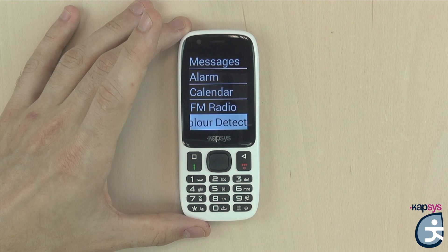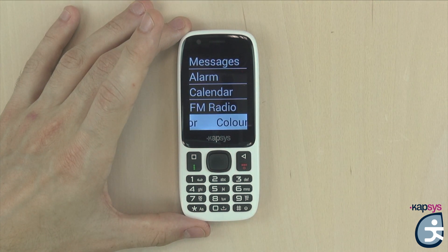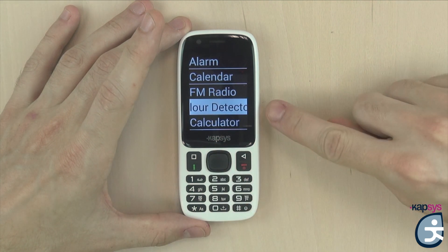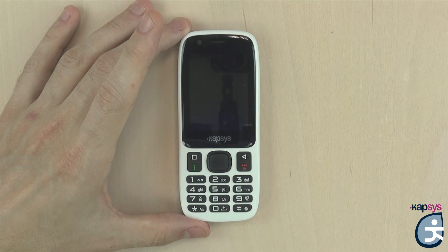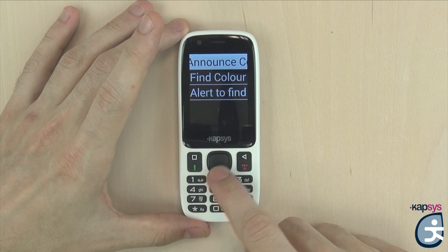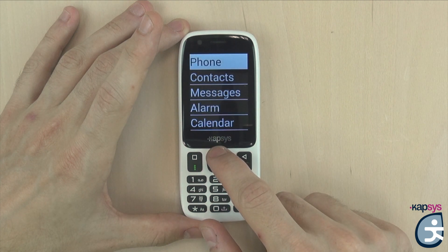By default, the text displayed on the screen is written in white on black. It is also possible to change the contrast in the phone settings. When you use the up and down keys to navigate, the selected item will be highlighted in the opposite color. When opening a new screen, Minivision always selects the first item in the list. When you return to a screen you have already opened, Minivision returns to the last selected item. When you reach the beginning or end of a list, a beep is emitted, followed by the repetition of the selected item.